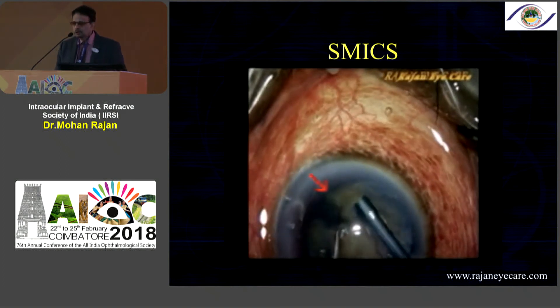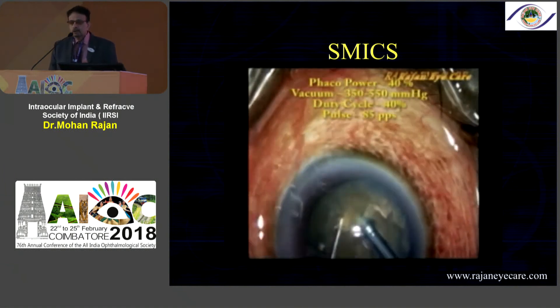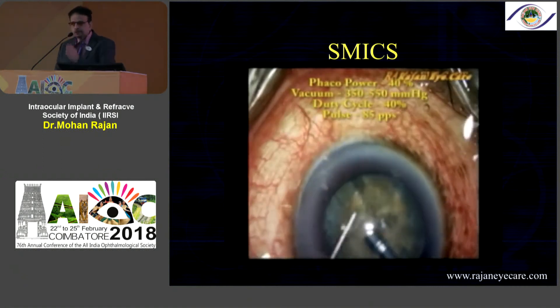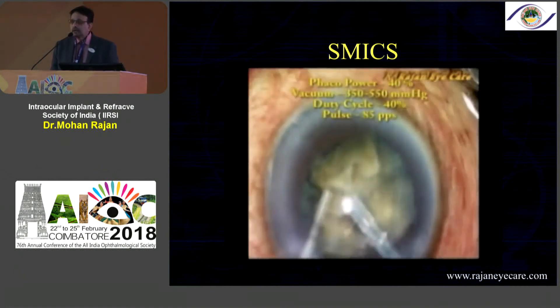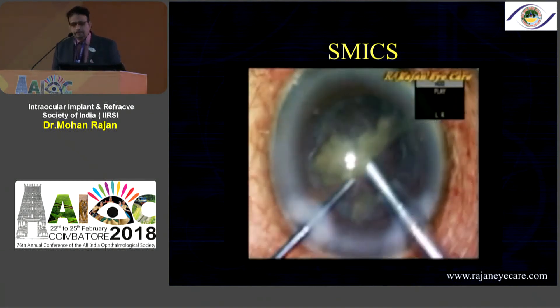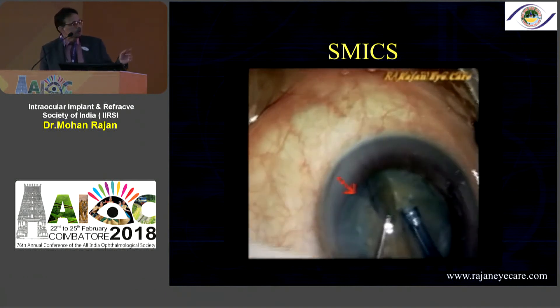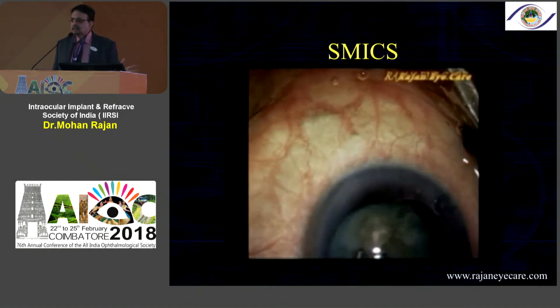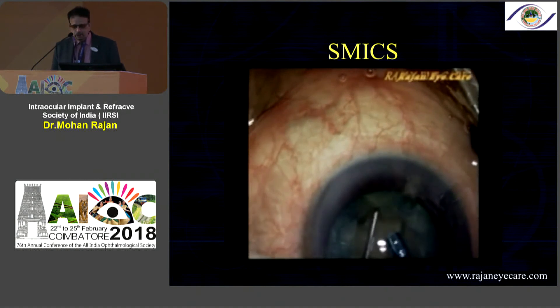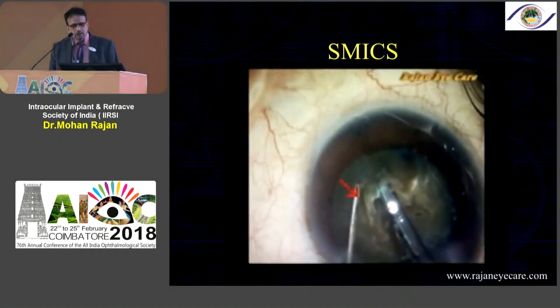You can see here I'm doing a micro incisional cataract surgery. The first chop is very important and that is the reason why you should use a sharp chopper — if you use a sharp chopper you can see the posterior capsule through and through, and then you attack each of the halves. You can almost close your eyes and operate — the patient should not close his eyes, that is important. You can close your eyes and operate because everything is on automatic mode, like driving a Ferrari — it's just so safe. Driving a faster car is actually safer than driving a slower car.